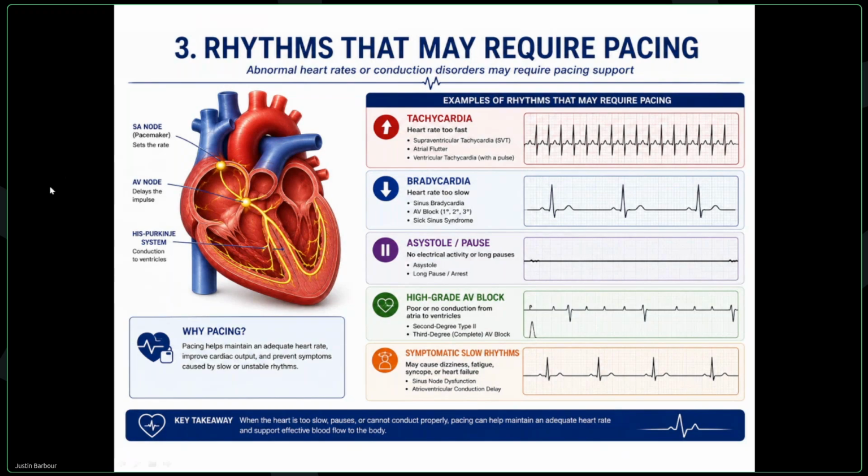The fact that they can shove electrical probes right down here, comes through the valve into the heart, and it fires electrical signals inside the heart internally instead of externally. I would imagine it would be more comfortable to be transvenous paced than transcutaneous, because if you can imagine electrical probes being placed on the outside of your body and you're sending zaps through your skin, that's going through all your surface layer nerves and it's zapping the heart itself way on the inside.